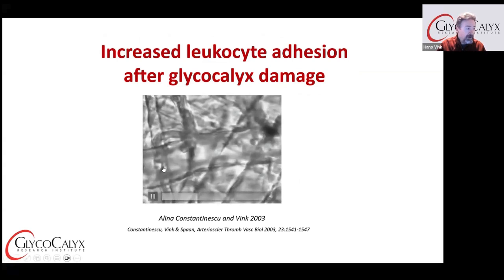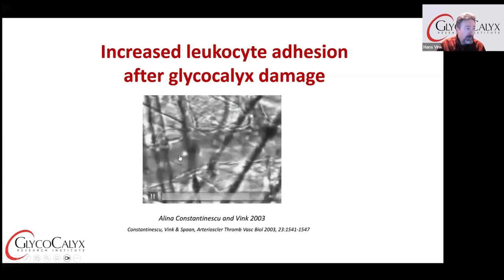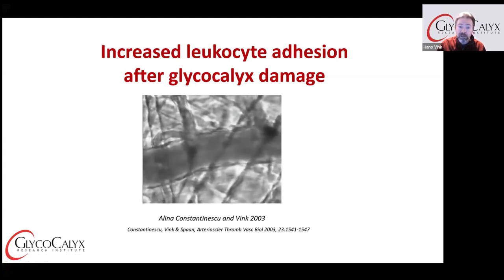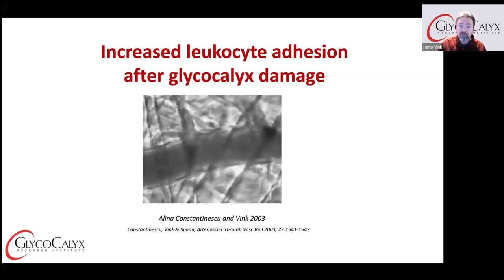the vessel. So you see when we flush out the blood every few seconds, you see the slowly moving, transparent, bigger cells, which are leukocytes, and they are slowly rolling over the endothelium much slower than the blood flow. And that's the normal physiological rolling behavior of the leukocytes.